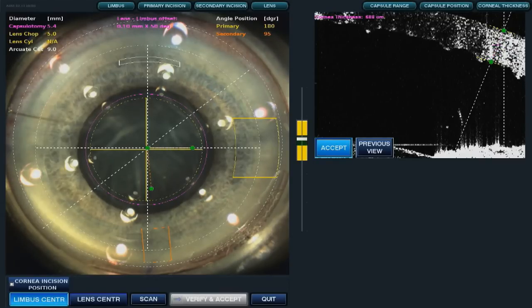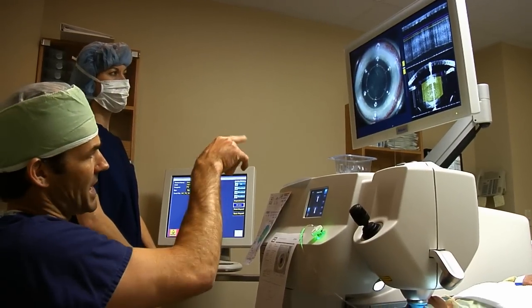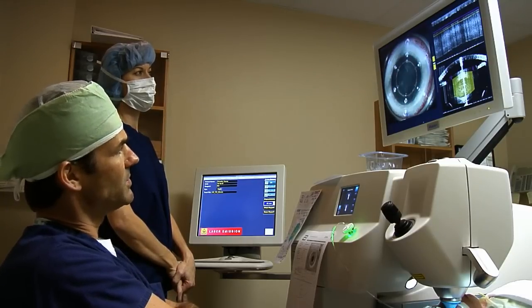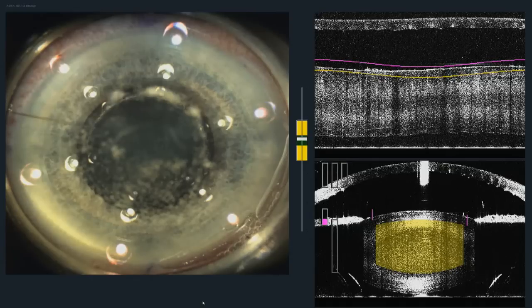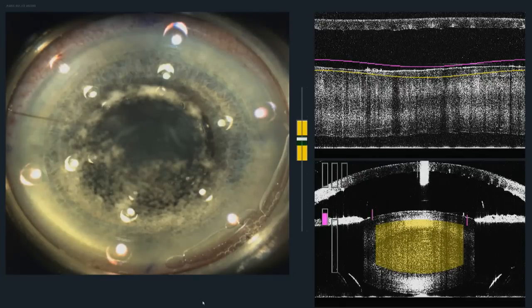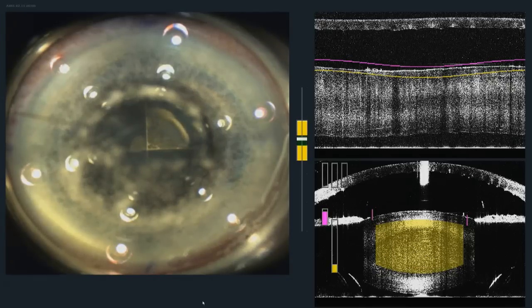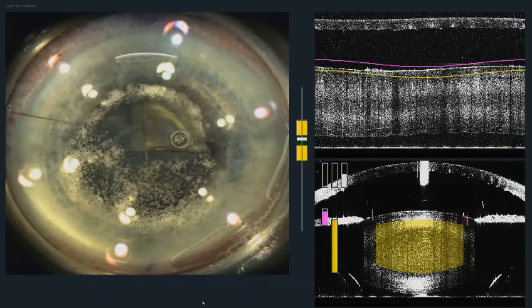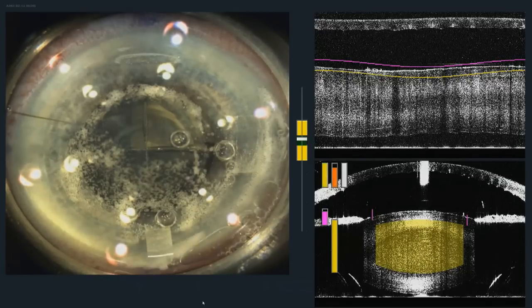The chance of perforation is less. The laser first will affect the capsule — you can see it just went around right there and has treated the capsule, making a perfect circle. It's going to go back around, moving posterior to anterior, making sure it gets the entire capsule. When you see those bubbles coming through, that means it's completed treatment there. The camera's going to go out of focus as it focuses into the lens — so it will be blurry for a second. There are different patterns you can use; I like to use the cross pattern. Those are air bubbles being created. Then there's the astigmatism correction, there's the wound, and then the side port incision is made — and we are done.